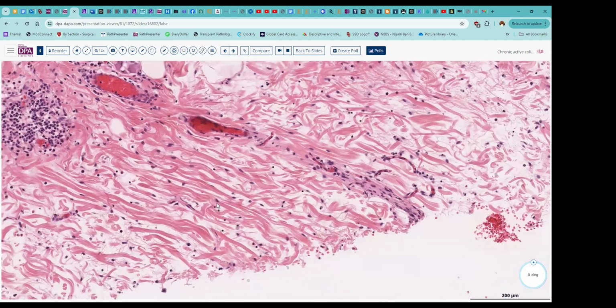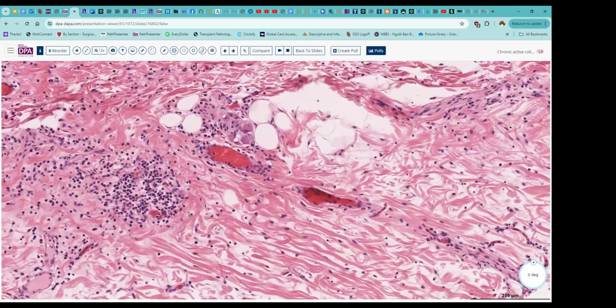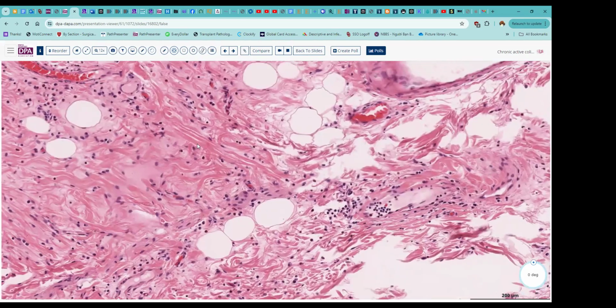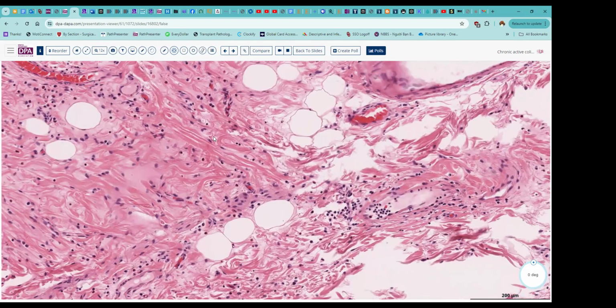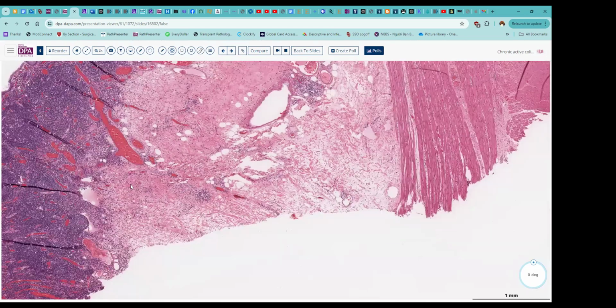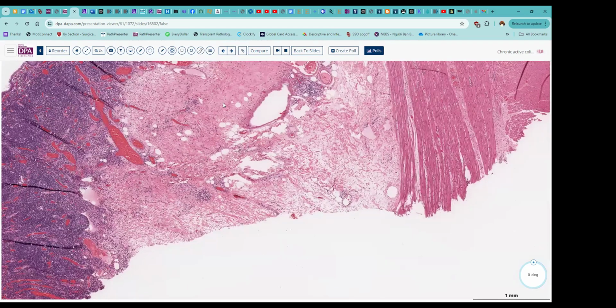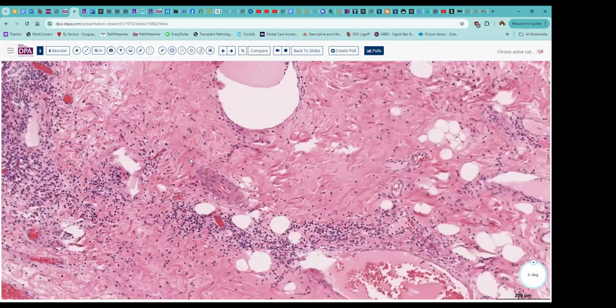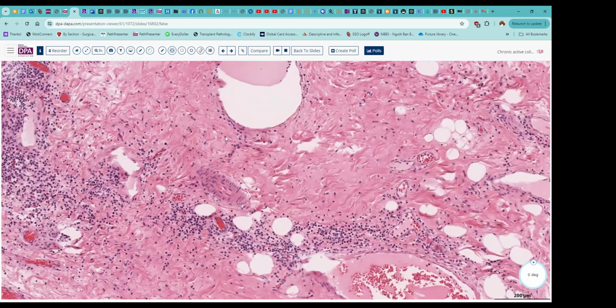Well, one of the features that you can get with inflammatory bowel disease is a marked hypertrophy of the muscularis mucosa. And that can sometimes take this pattern of a very broad, indistinct zone of muscularis. Here it is very edematous and so forth.